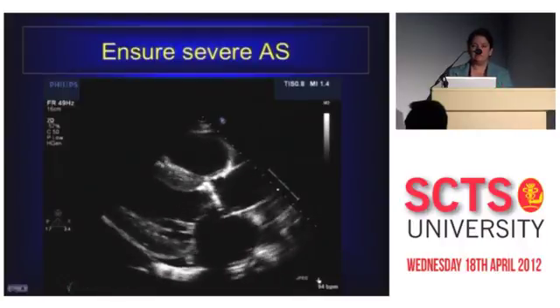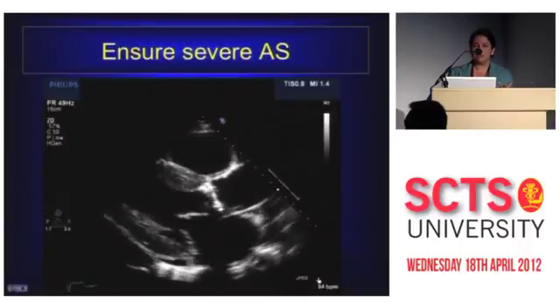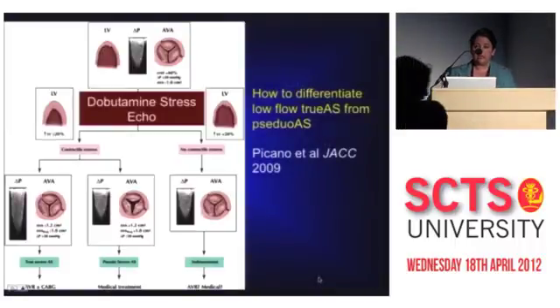So in this particular example, has this patient actually got severe aortic stenosis, or is the aortic stenosis looking severe because of the left ventricular impairment that you can also see? Now, echo has a role in trying to tease out those issues, and this is not standard resting echo, but functional imaging with dobutamine, which can tease out whether a valve really is severe when you get the ventricle going with the inotrope. If the valve opens up better, then you're looking at pseudo-aortic stenosis, which was looking awful because the ventricle was poor.